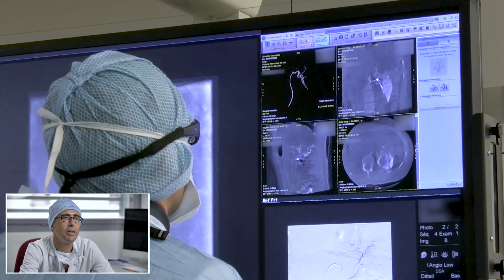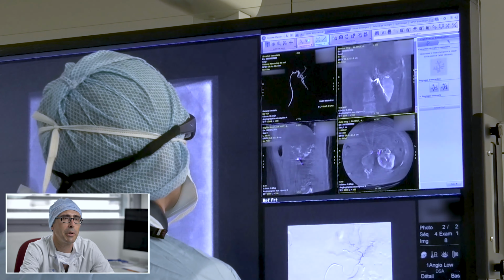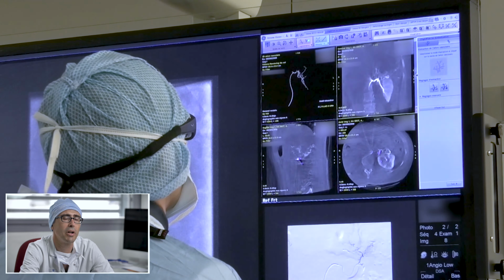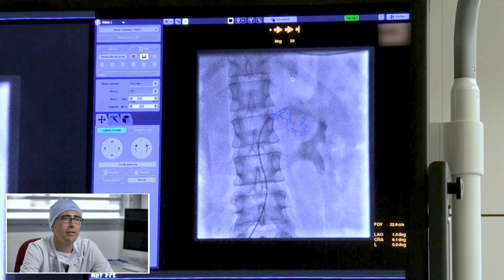We perform an embolisation of an angiomyolipoma. This angiomyolipoma measured 10 centimeters, and we were trying to avoid complication on the renal parenchyma. Firstly, we perform a cone beam CT from the renal artery to visualize the normal anatomy and the lesion. Then we perform the embolisation after catheterization of the arteries to the angiomyolipoma. Finally, we control the embolisation using the cone beam CT too.